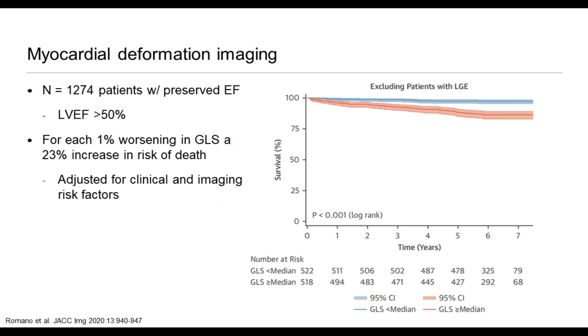Primarily, this is done with echocardiography, where this is long known to be a valuable technique, but now it's also available in MR. And the information is there, so we just need to extract it and put it in our report.